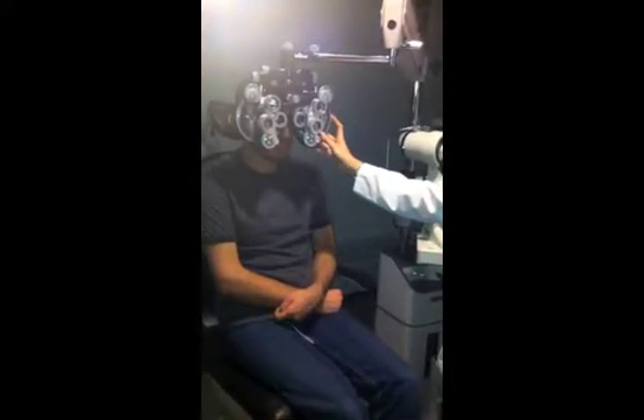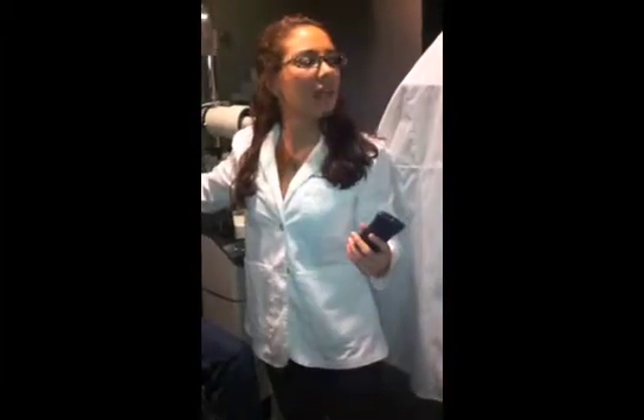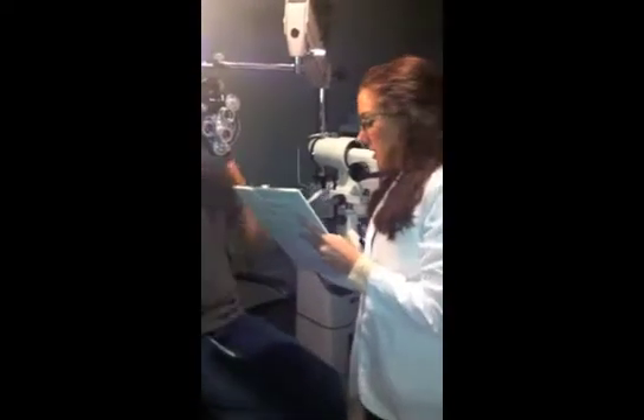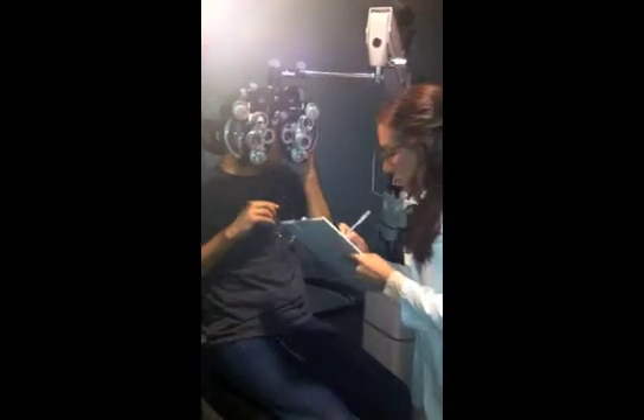Is this clear for you or the same? Yeah. A, R, F, S, T, H. Excellent. Is this clear for you or smaller and darker? No, it's the same. So we got 20/15, minus 2, minus 6, minus 2, axis 125. This is what we go through. Awful stuff.